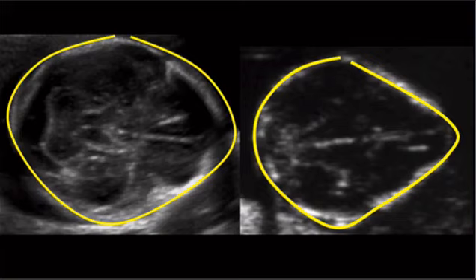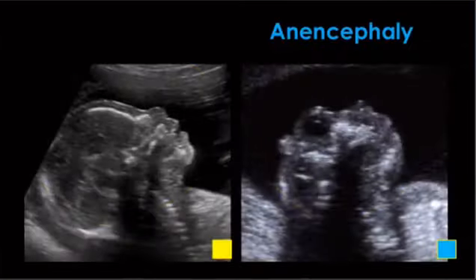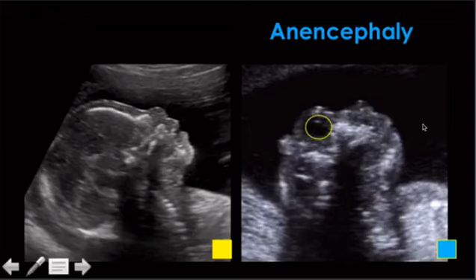So you'll see them. This is only seen during a certain time period. Both of these are neural tube defects. As I mentioned, another neural tube defect. So we've got a normal profile here. And this is the way that they typically will show anencephaly, this profile here, because they want you to see this, which is the orbit, because anything above the orbit is supposed to be gone with anencephaly. So you have total absence of the cranial vault and brain above the level of the orbit.